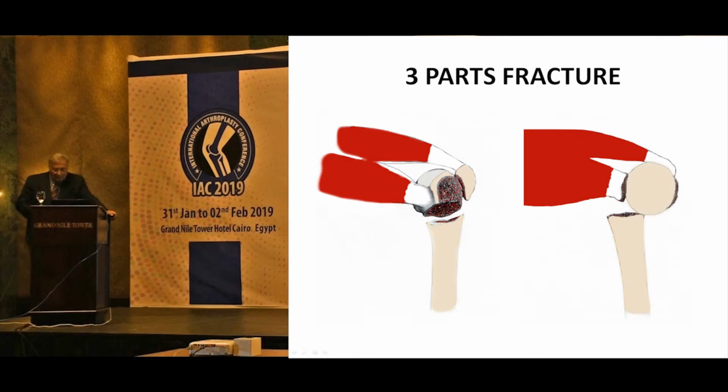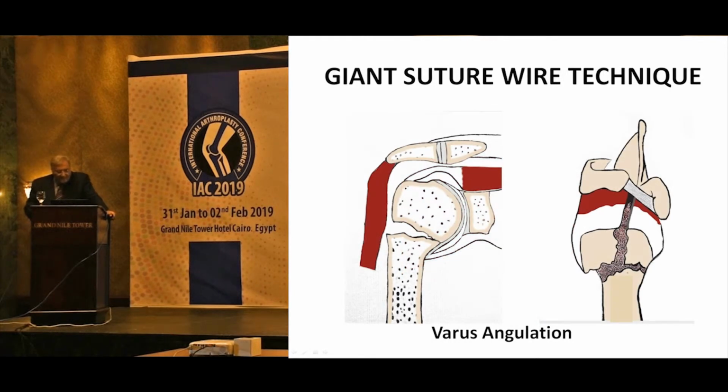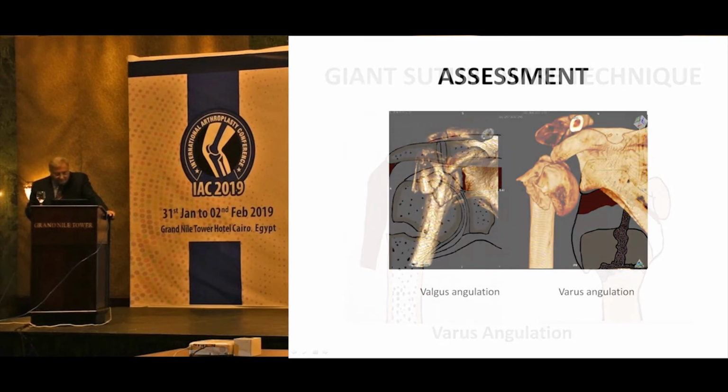head and lesser tuberosity, or in some cases of the 4-part fractures with a surgical neck fracture and less displacement. This technique is based on correcting the angle of displacement of the head and bringing the 2 tuberosities together.